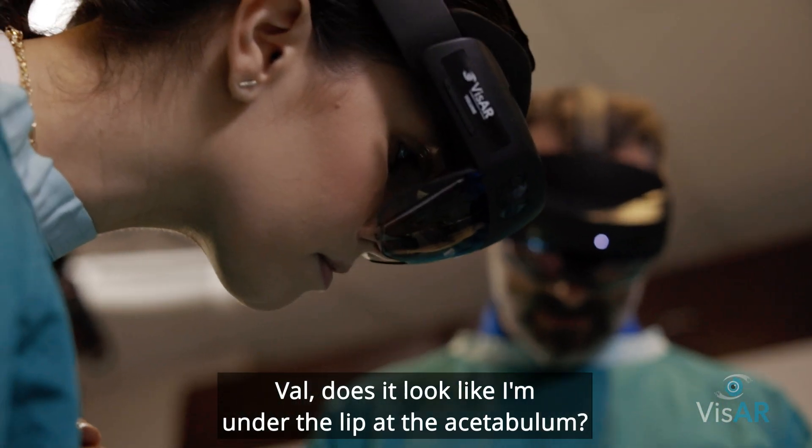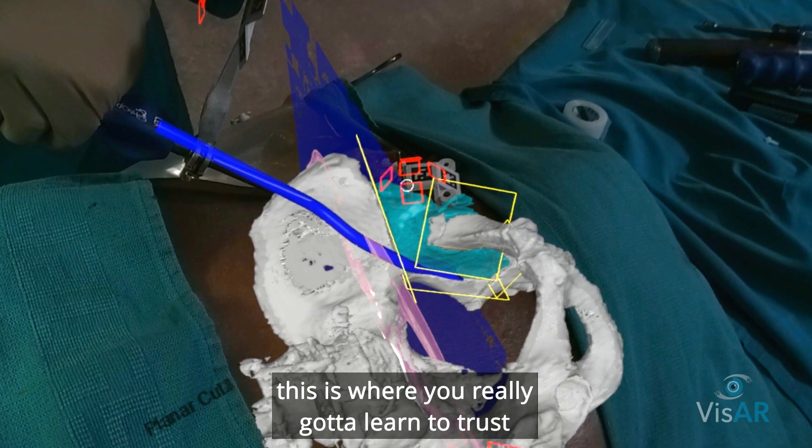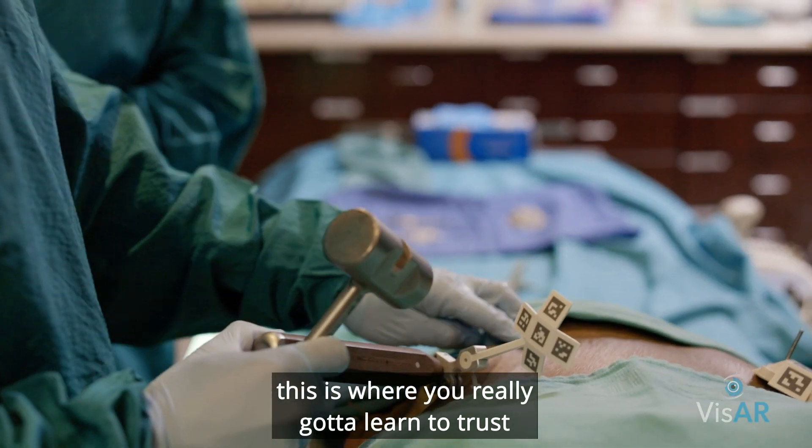Does it look like I'm under the lip of the acetabulum? Yes, you are. I have no idea where my chisel is visually — this is where you really have to learn to trust your navigation.